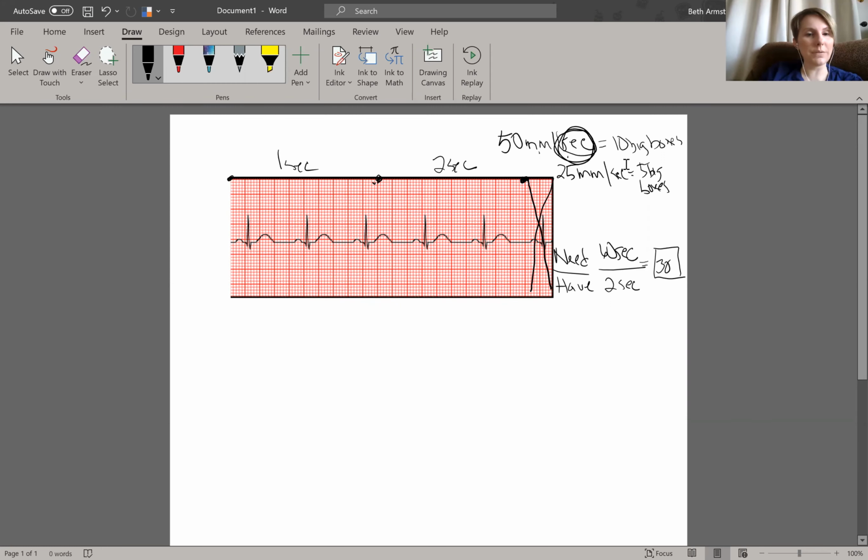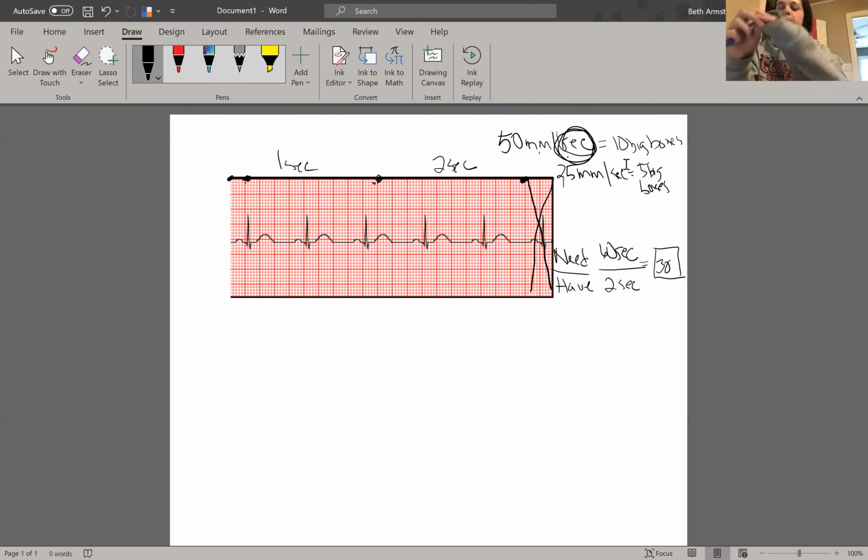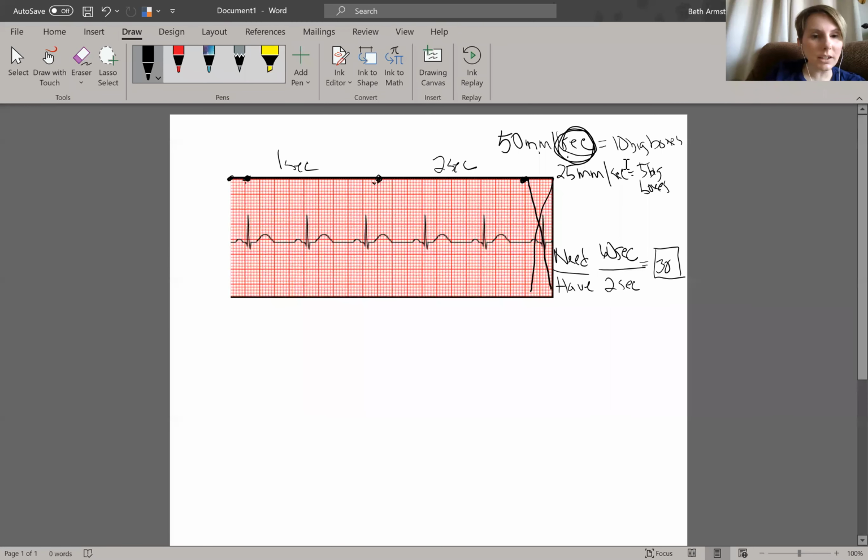Correct, correct. So if there were not 5 boxes here, you could start right here. But in this case, there are 5 boxes right here. So I counted this box. It's just that there's not a line right here. That's all. So that's why I started there. Oh, okay, now I see. Yeah, and that's why I was wondering, should I count there? But if I started here, then I couldn't count this one. So I just started there. Okay, perfect.